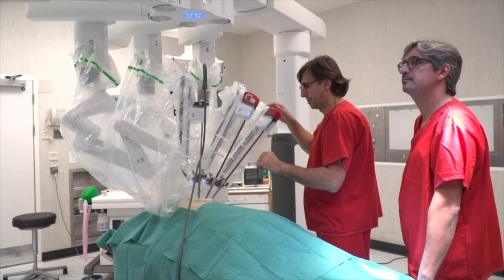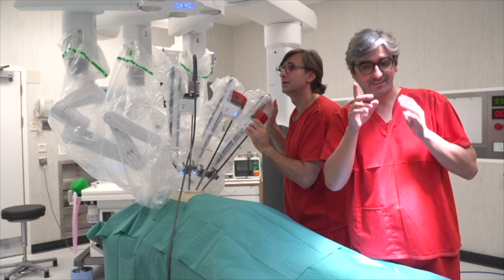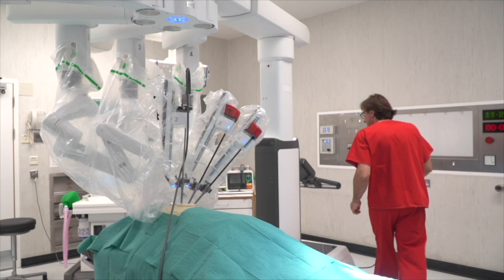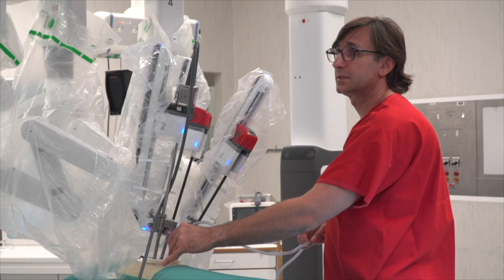You also use the direct vision for positioning. It's important: the screen and the direct vision. It's because you have an utility incision, so you can see through the incision, just for placing the arms. And then you are ready to go, so now we have the console surgeon. The console and here, we'll take the suction. Okay, so now I'm ready, you see? To go everywhere. And the assistant with the suction will follow the surgeon.